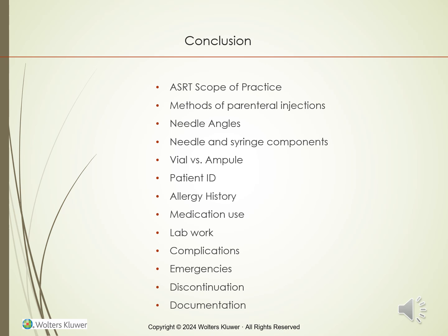Other complications include an air embolus, phlebitis, or drug incompatibility, and the fluid level falling below the level of a spike when using a bag or a bottle to administer the contrast. Discontinuation of an IV must be ordered by the physician, and you need to ensure the appropriate steps in removing the IV. Documentation of administration must be done correctly, and you must include the patient's name, date, time, amount, route, as well as any reactions. The radiographer and the physician must sign the document. All documents must be filed in the patient's medical record.